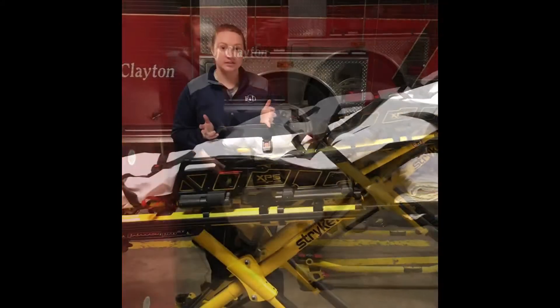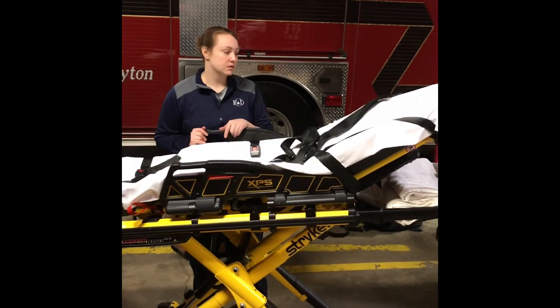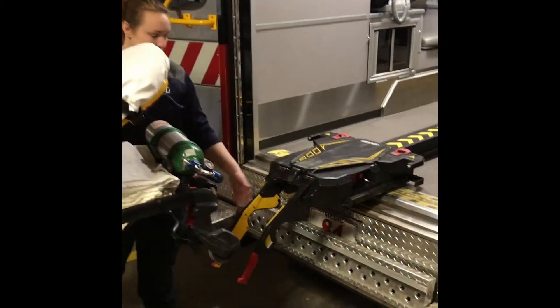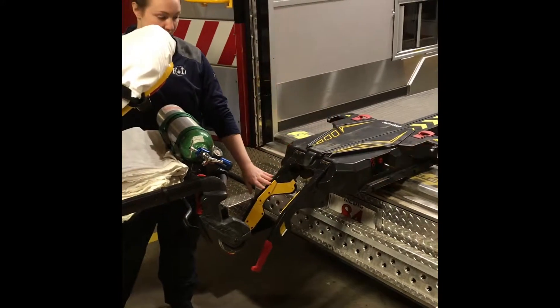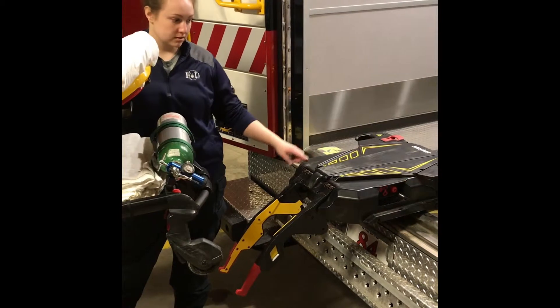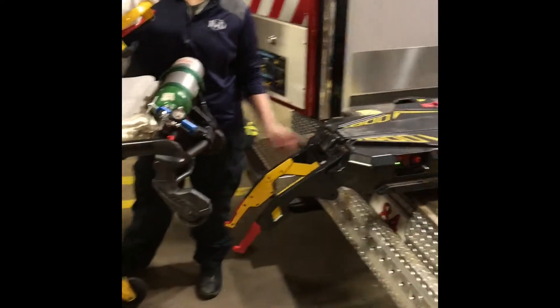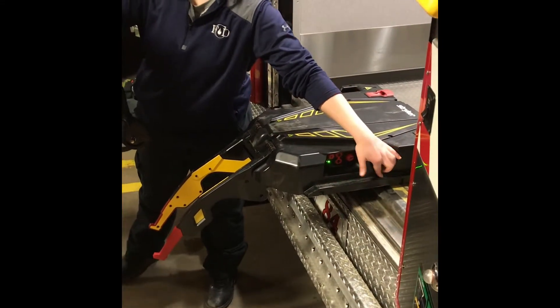This section covers how to load the cot into the loading system. First, you want to make sure that your track and your load system are actually pulled out and in this position — this is the load position for the cot. Arms down, lights are flashing, it's ready to be loaded. You want to make sure that your wheels — these pins on your wheels — are lined up with this track, because that's where they're going to sit.